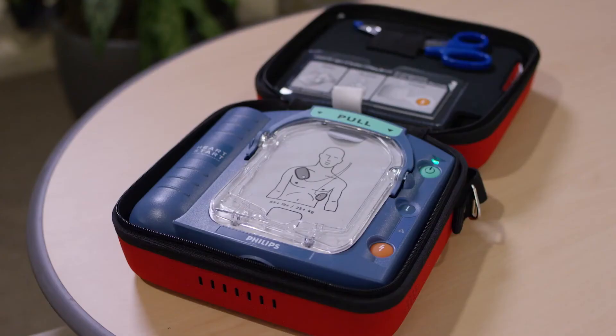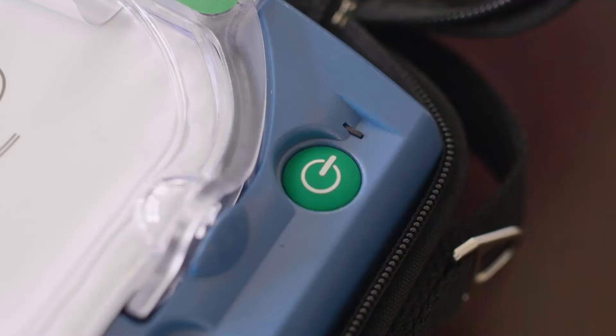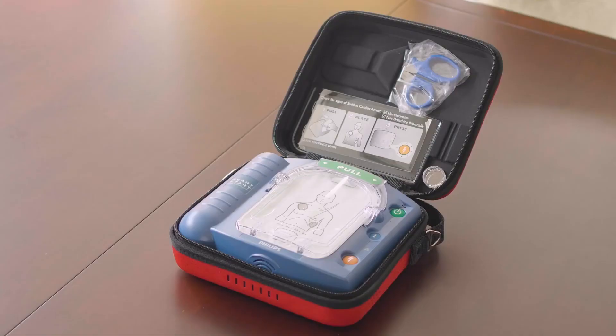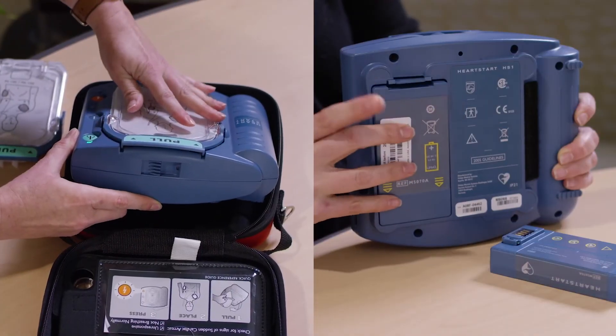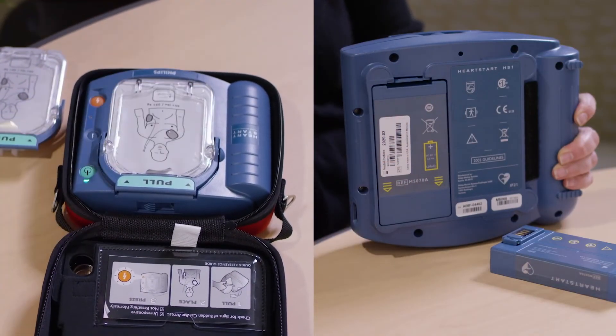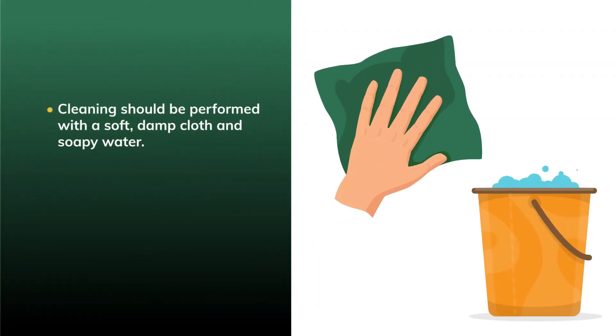The HeartStart Home AED performs daily self-evaluations of all systems, including the battery, and also tests itself to confirm that the pads are installed properly. A blinking green ready light lets a potential user know that the unit is ready. After using the HeartStart Home AED, check the outside of the unit for damage or dirt. If necessary, clean it with a soft, damp cloth and soapy water.